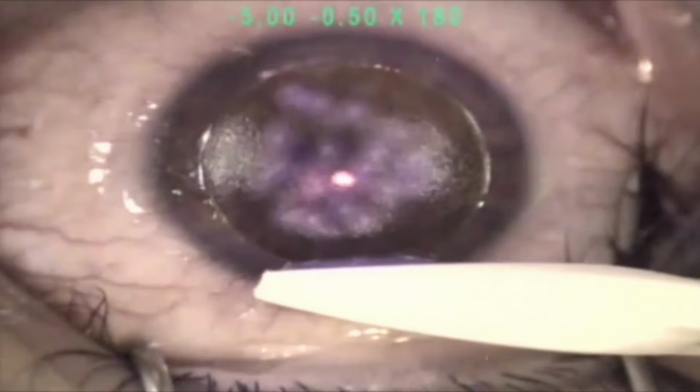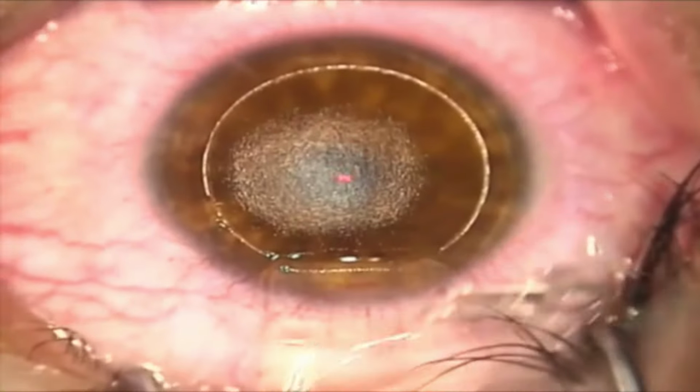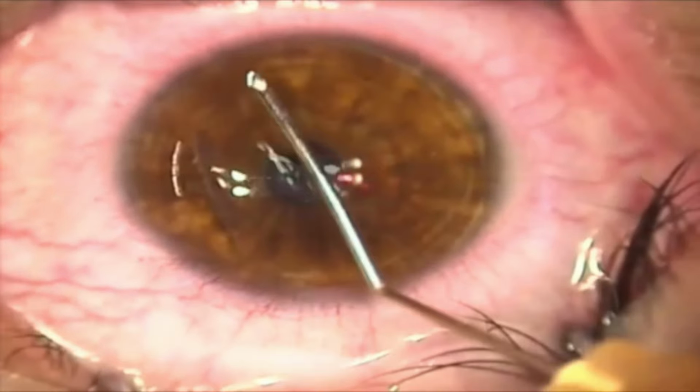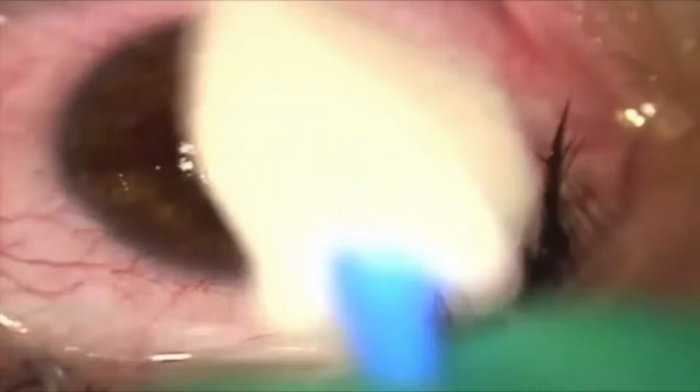Here you can see a spherical treatment, which is a moderate myope, -5, and then a slight astigmatic treatment of a with-the-rule half a diopter. Next, we'll use a small amount of BSS to gently reposition the flap, and then we'll irrigate with a very small amount of BSS also in the interface. We'll smooth the flap with Weck-Cels.